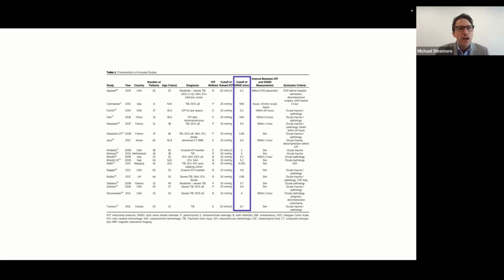Okay. And so I think the one caveat to take home if you start using this technique in your clinical practice is that a single measurement on a single patient isn't going to give you a ton of information. The real beauty of this technique is measuring the same patient ongoing to see how they change over time or after treatment or after diagnosis. That's where you're going to get it, because each patient's so different.